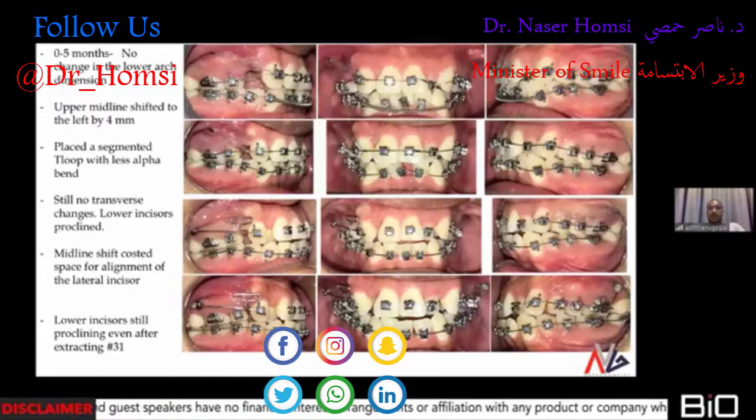So I tried to convince the patient that I'm going to be extracting 1 lower incisor, and then it should still be okay. I would be able to correct the crowding as well as the inclination of the lower incisors. But as you can see in the third row, even after the extraction of an incisor, I was not able to correct the proclination, because I was not able to get the desired amount of expansion that I probably thought I would achieve.